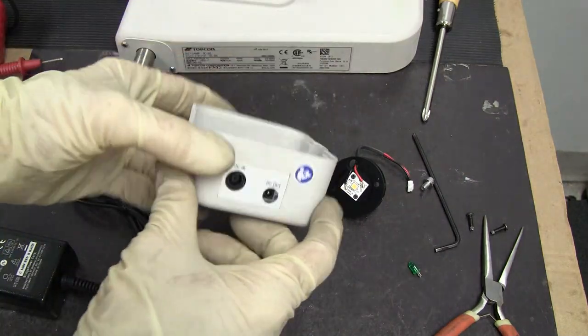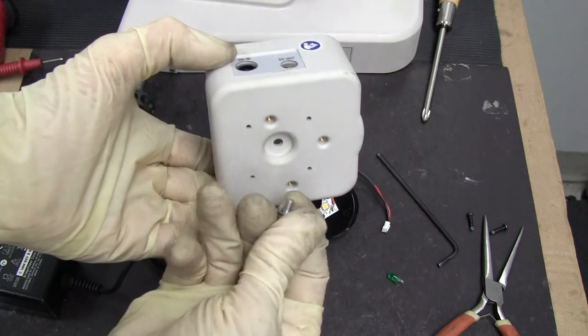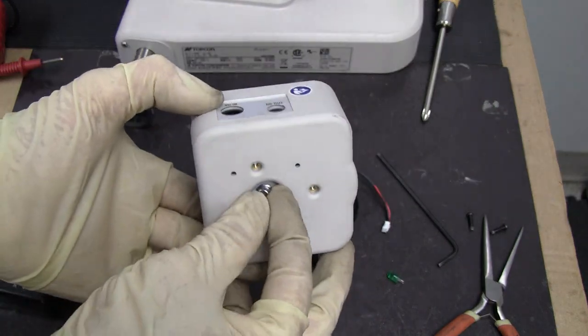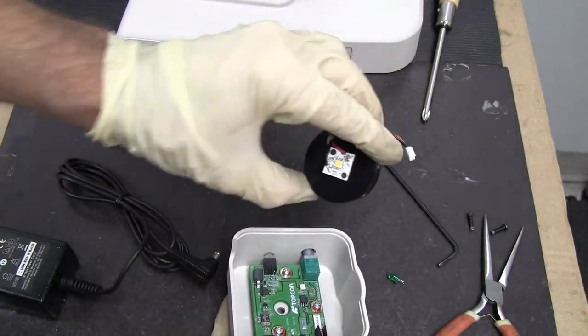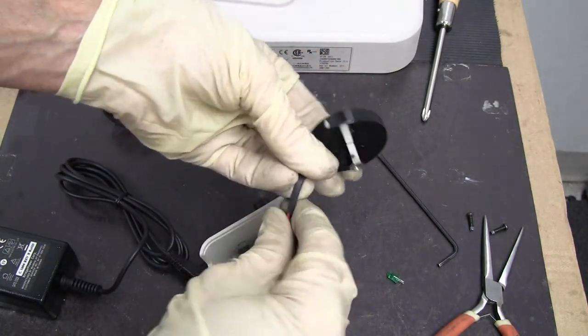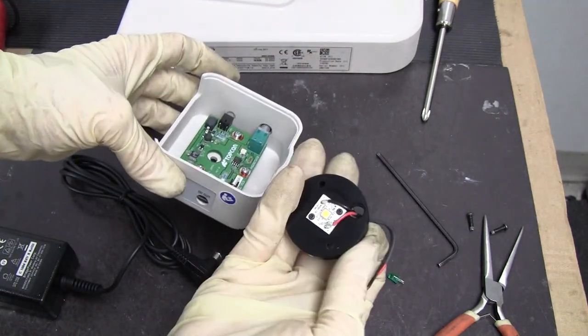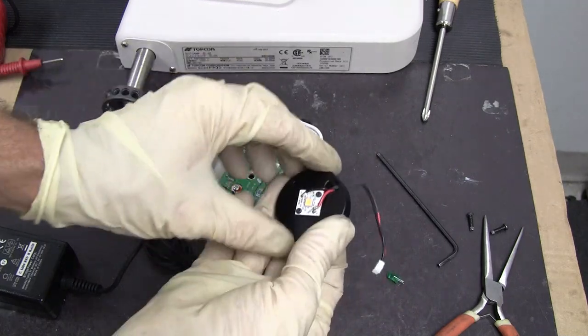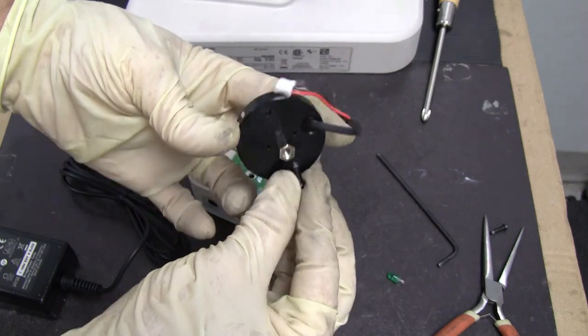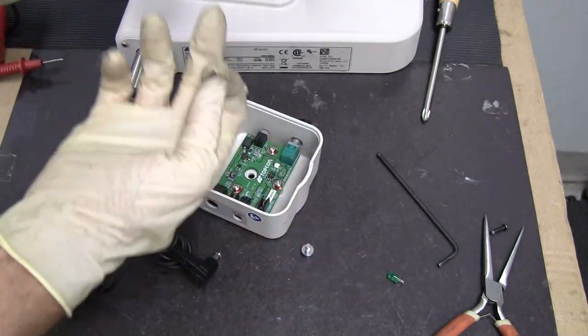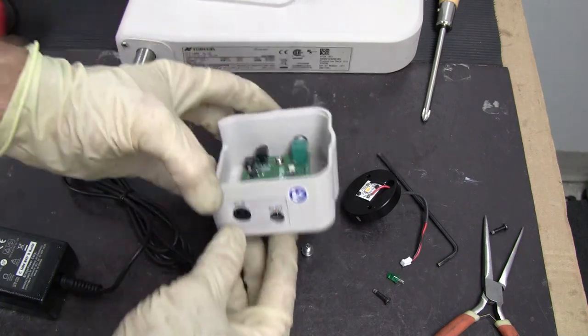I've taken this off the bottom, which is held on by an Allen screw. It also has the LED plugged into it, but I've taken this off for now. This comes off with two screws, two Phillips head screws.